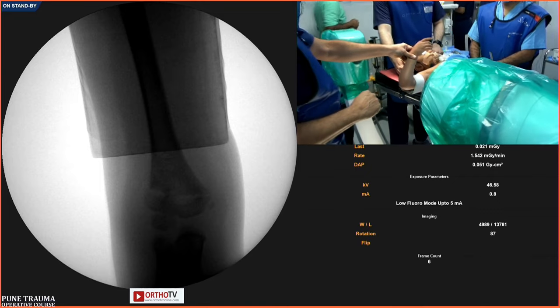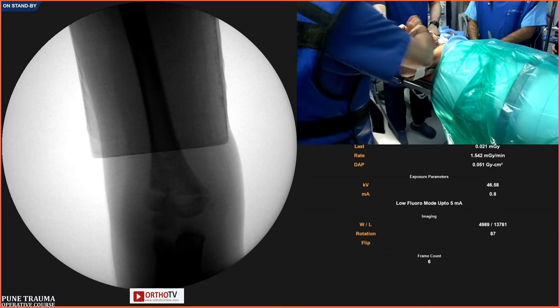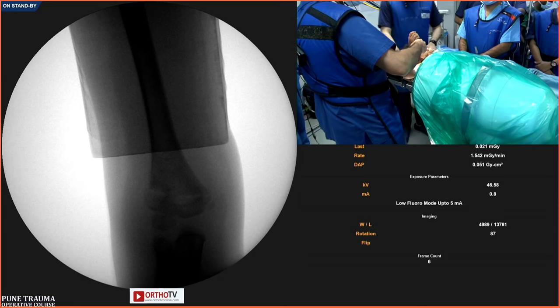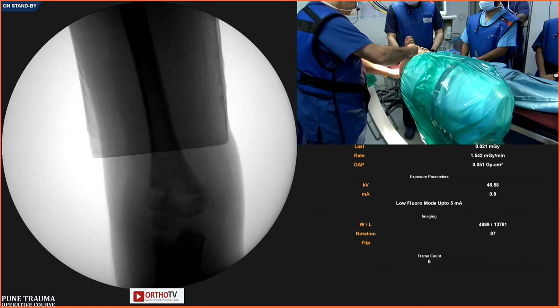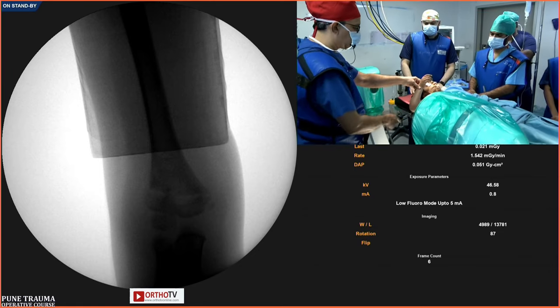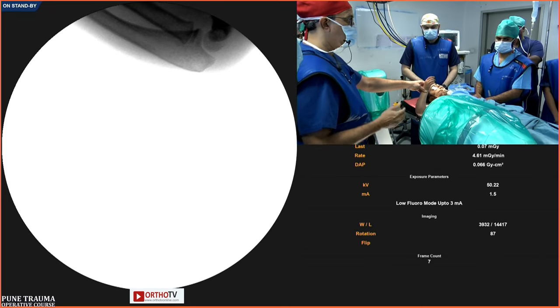Sandeep, some questions here. We see the humerus and the elbow just jutting out. What are the tricks here? How much of the elbow do you keep jutting out? Is there any trick there? There is no protocol for it. You should be comfortable to access all round.